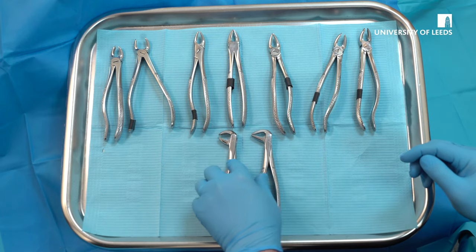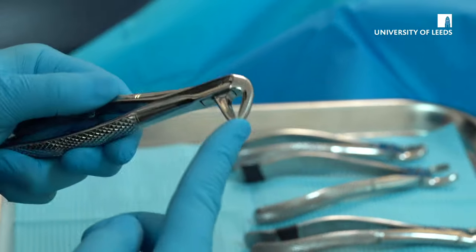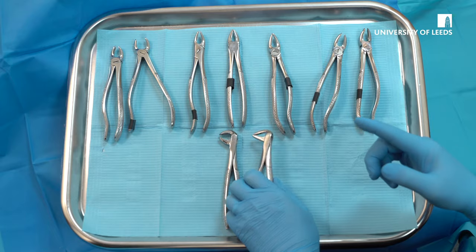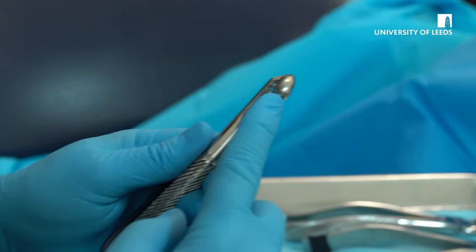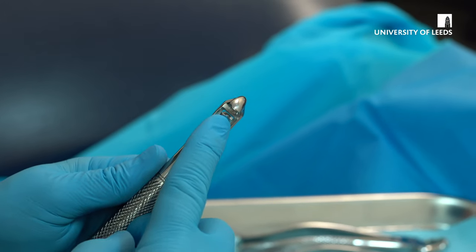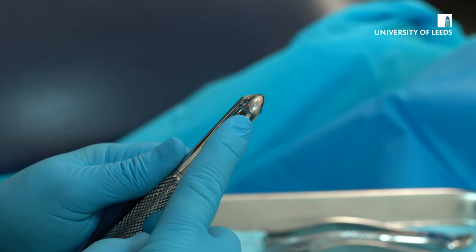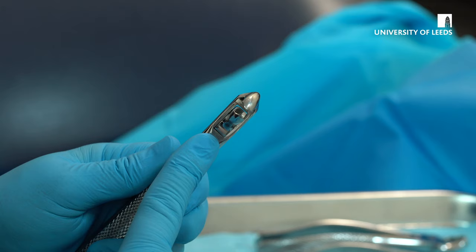The two forceps here are for lower extractions. These are used for anterior teeth, including the premolars. And these, you will notice, have beaks similar to the upper forceps and these are for lower molars. The beaks on all of the molar forceps are intended to aim towards the bifurcation of the tooth.